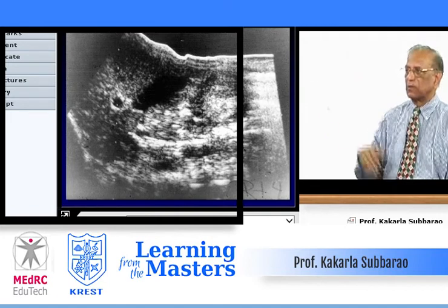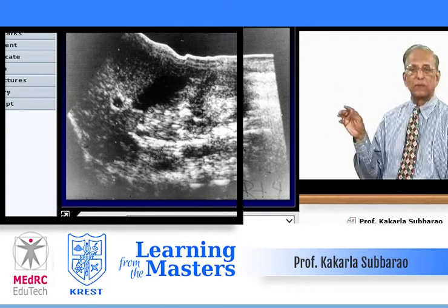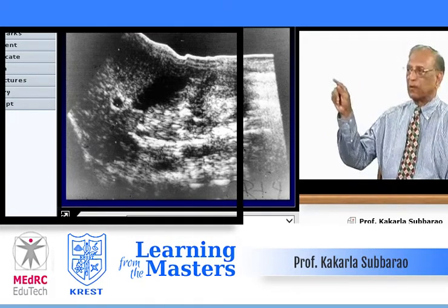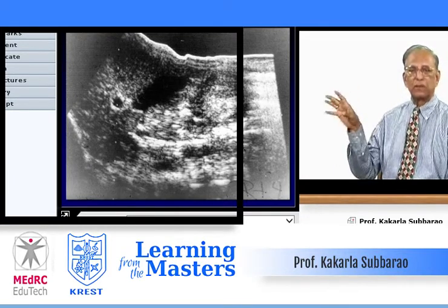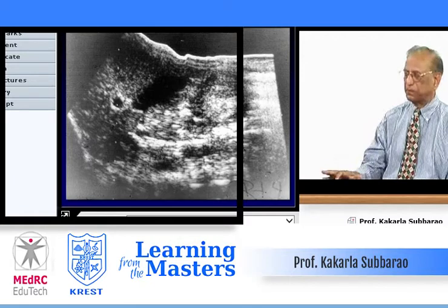This is what I was talking about, the target sign with ultrasound. Look at the echogenic center and the non-echogenic periphery, classical of intussusception.